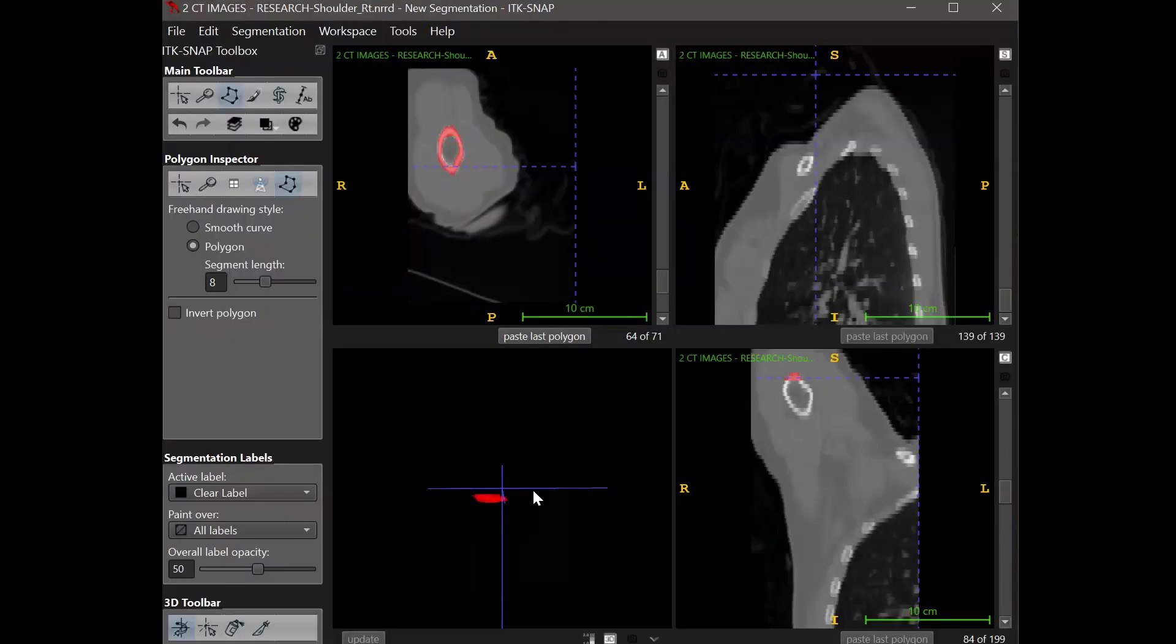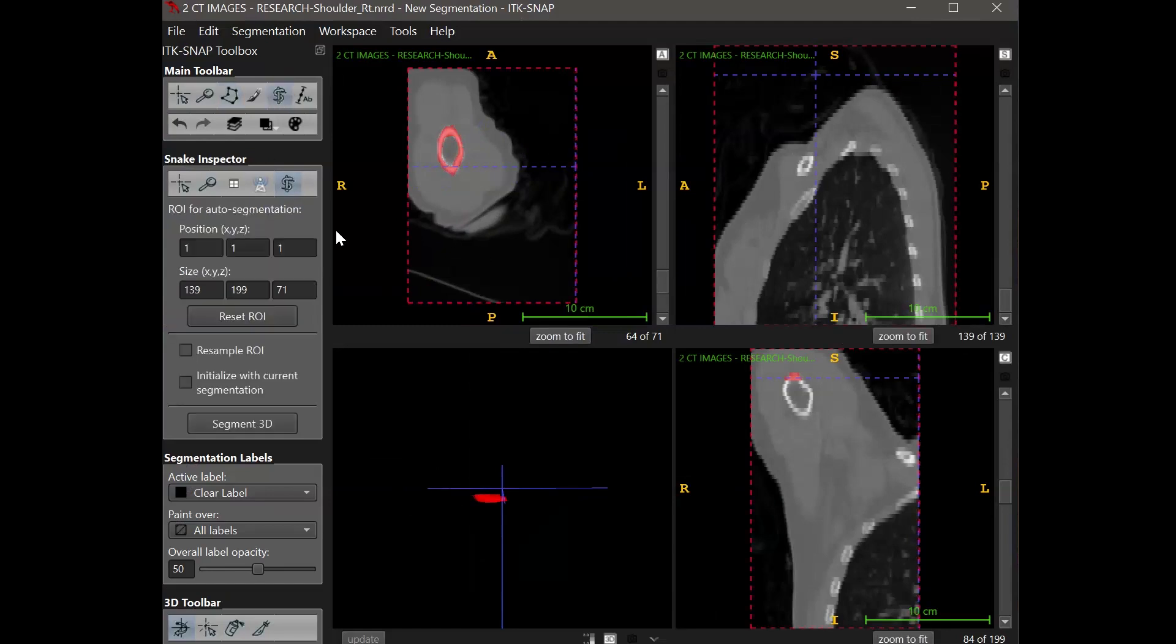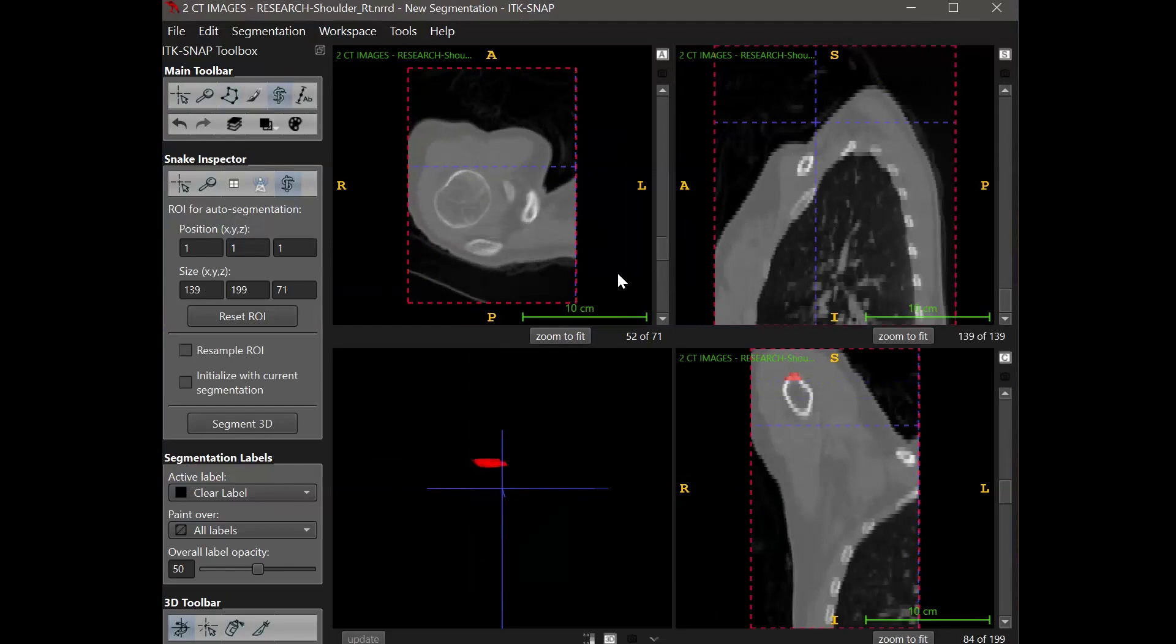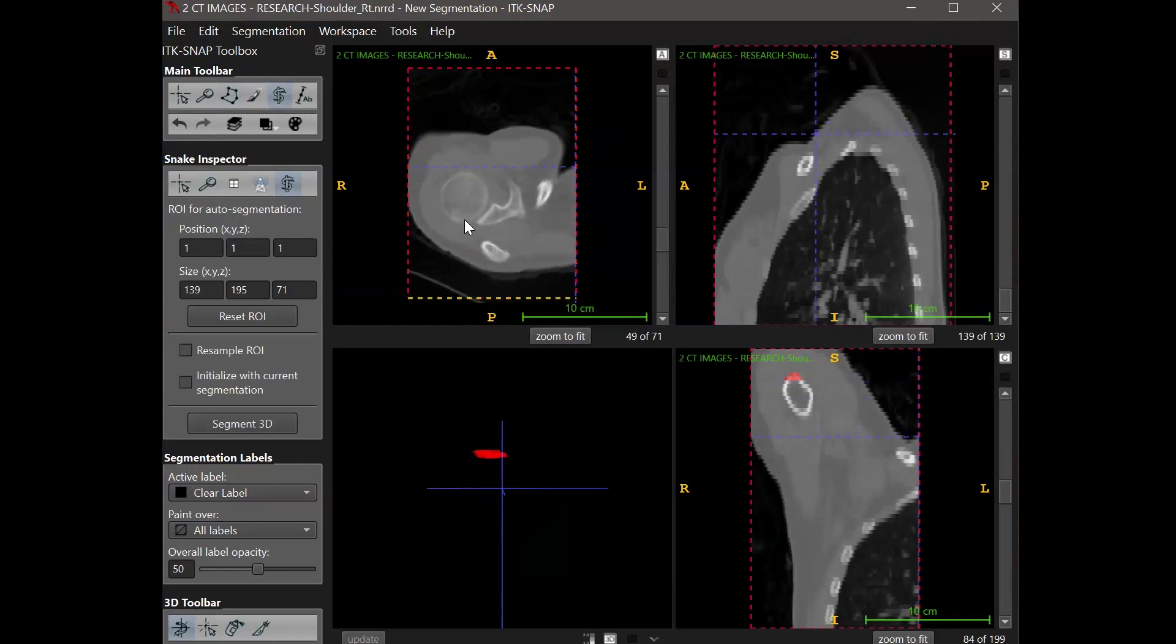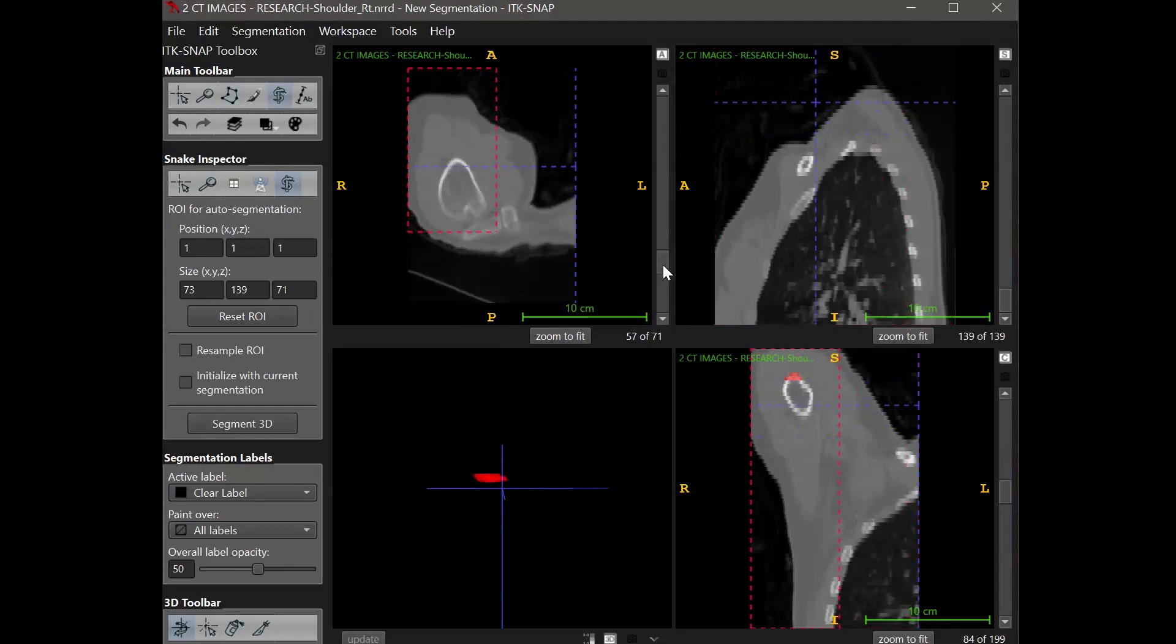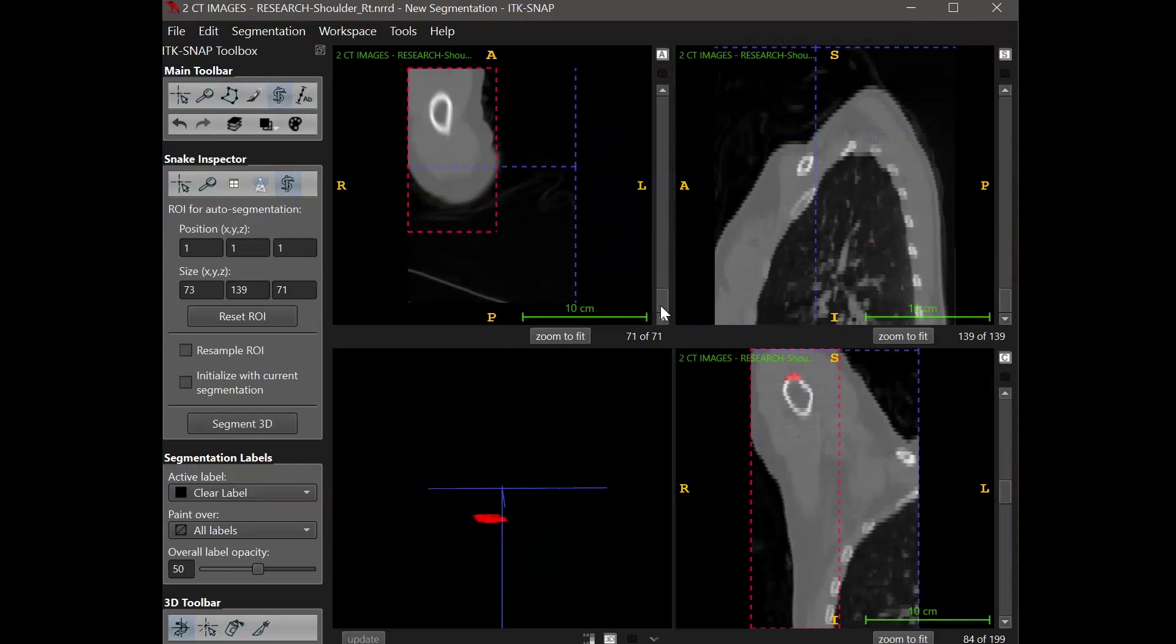When you want to begin the automatic segmentation process, you should select a region of interest, or ROI for short. In each of the views, you want to modify the dashed box to encompass just the region that you're segmenting.